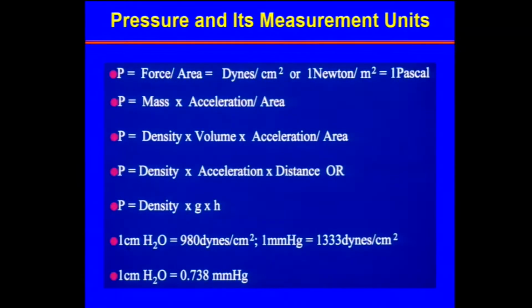Today is supposed to be a talk about hemodynamics, how they are assessed non-invasively. When we say the word hemodynamics, people think of pressure, people think of work, people think of flow. So we will try to give you an idea how you get to these quantities non-invasively.